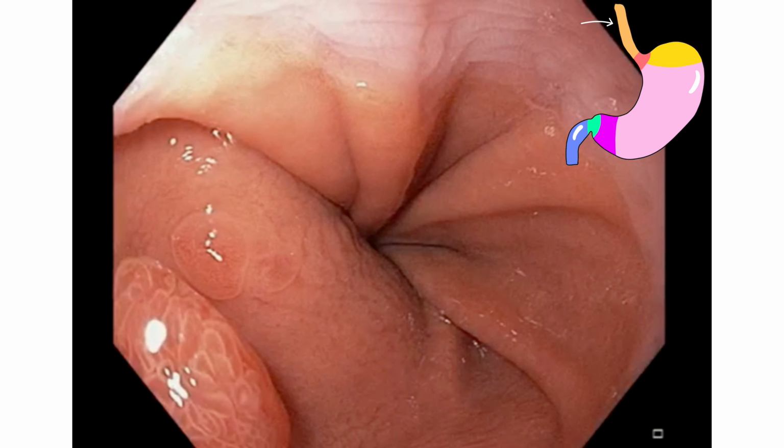Now we enter the stomach, and again, there are no signs of significant inflammation or occupying masses in the stomach. This place right here is the pyloric region. This is where Helicobacter pylori usually sits between the gastric cells. If we consider it necessary, we take a biopsy used for a rapid urea test to see if the infection is there or not. We will go through the pyloric sphincter. Then, we will enter the first part of the duodenum, the bulb. After that, we will examine the second part of the duodenum.